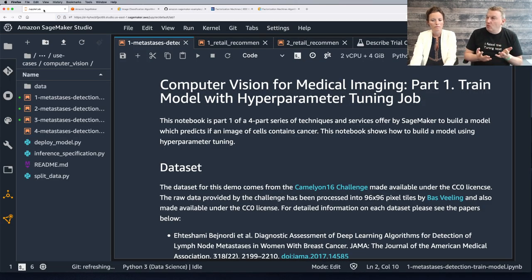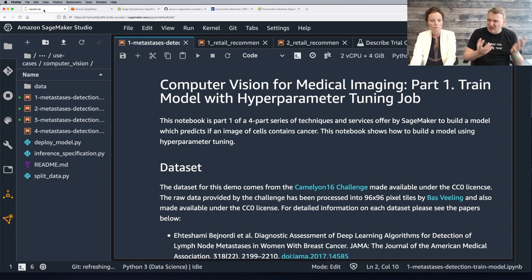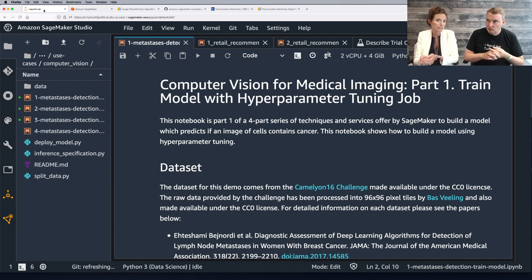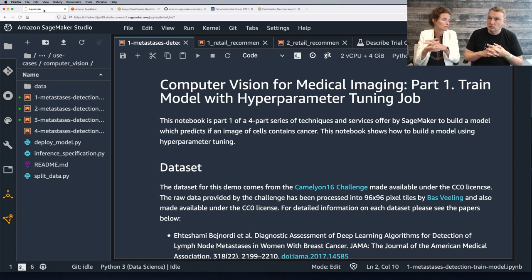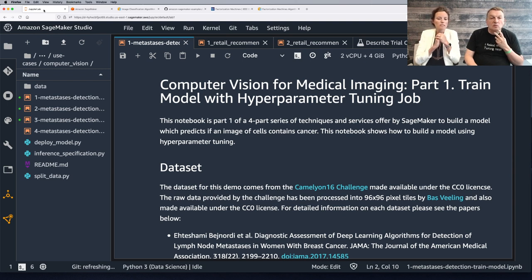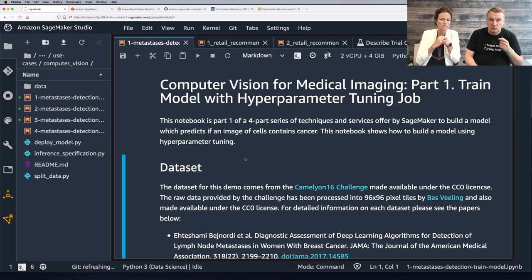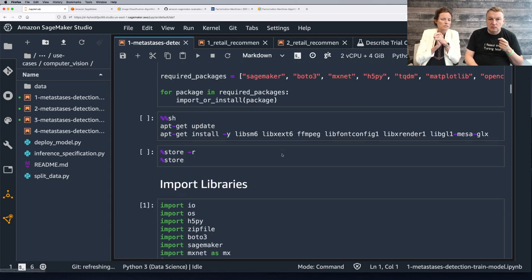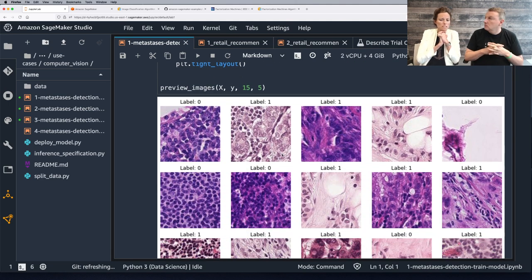So Ségolène, what are we doing today? We're using medical images and we try to predict whether there's a problem in there. Yes, exactly. So we are going to use some medical images and apply a deep learning model on top of these datasets. And we are going to be able to detect if there is a metastasis or not in the image. The dataset we are going to use for this demo comes from the Camelyon 16 challenge.